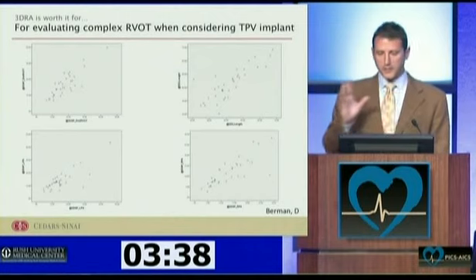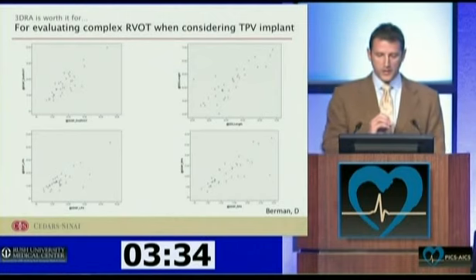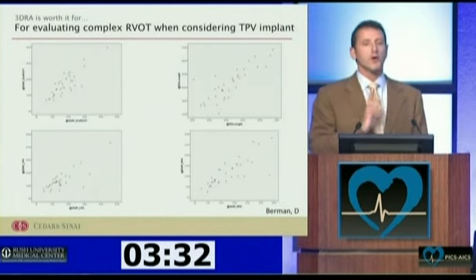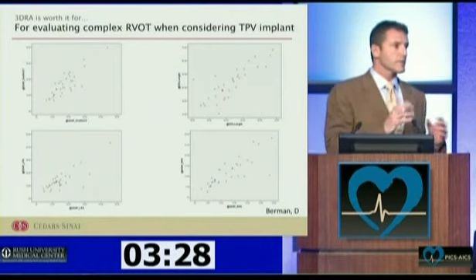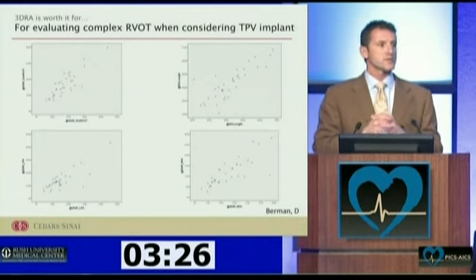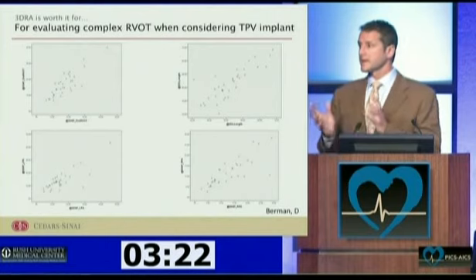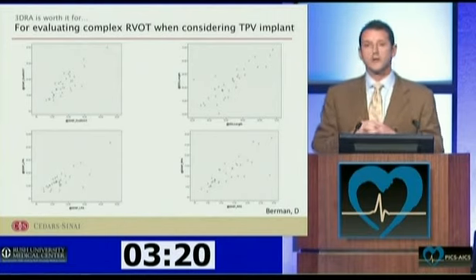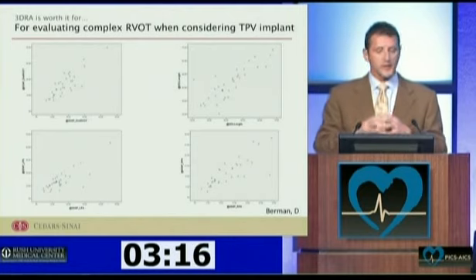So we started to look at this right before I left Miami, and the group continues to work on this. These are now measurements all along the right ventricular outflow tract, both length measurements, diameter measurements, relationship measurements of both the outflow tract and the branch pulmonary arteries, diastole, systole, what correlates to 3D-RA, because as was mentioned, the measurements we get from 3D are really averages.